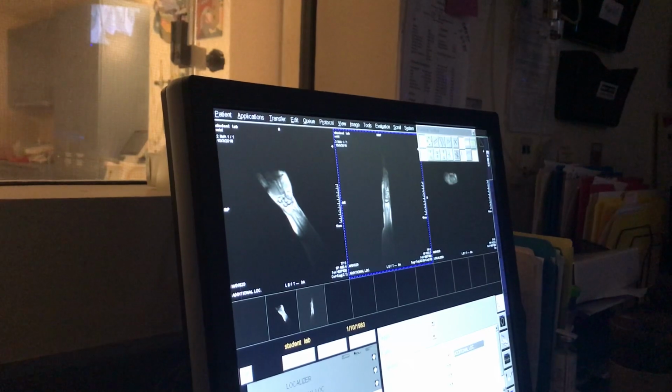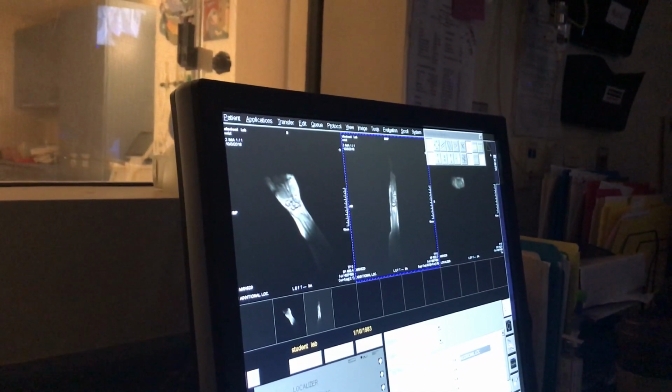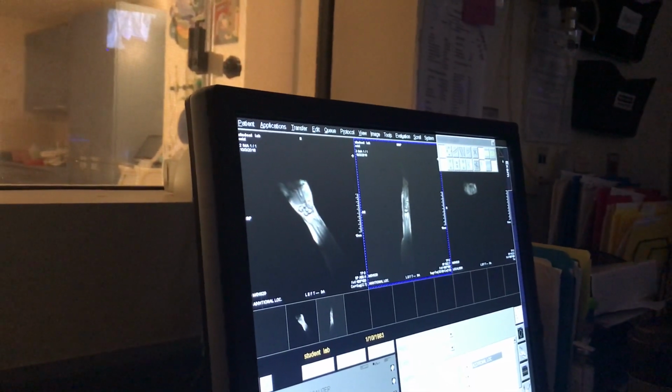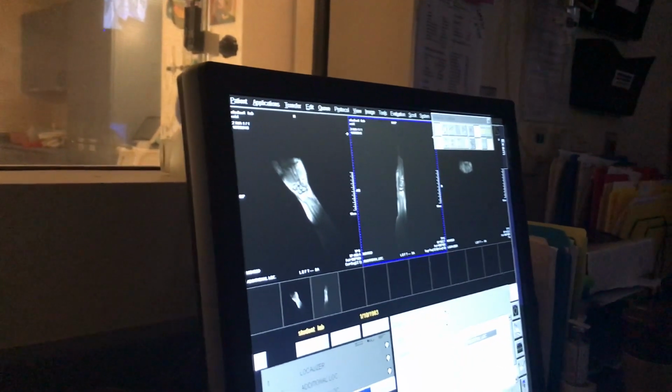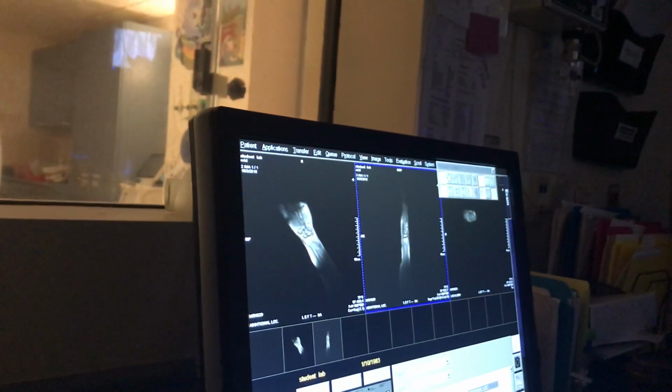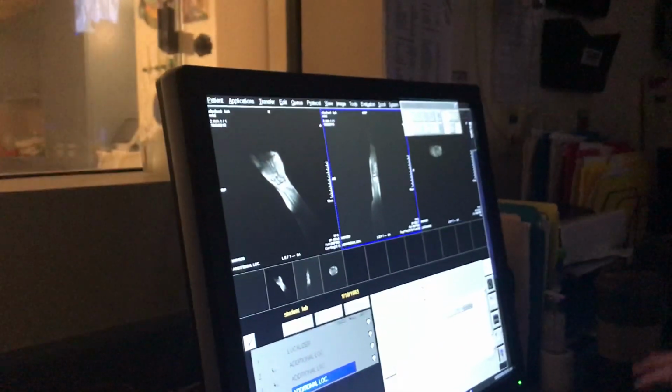So when this axial localizer comes up, we'll prescribe a very good coronal localizer, a very good sagittal localizer, and that way we have 3 true plane localizers to position our scans off of.